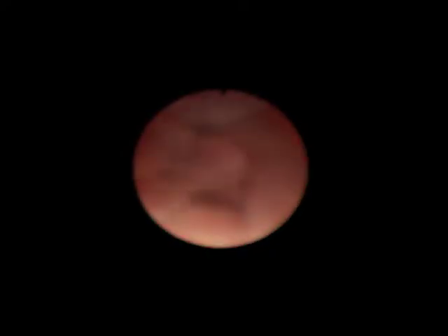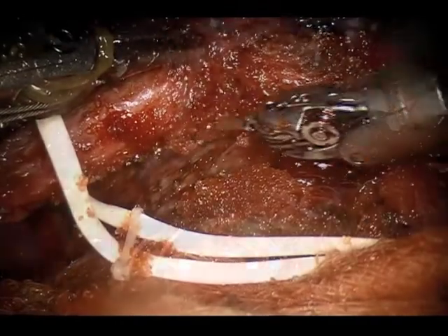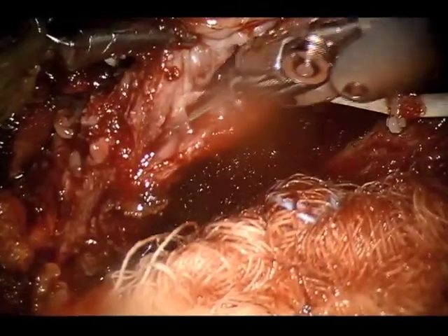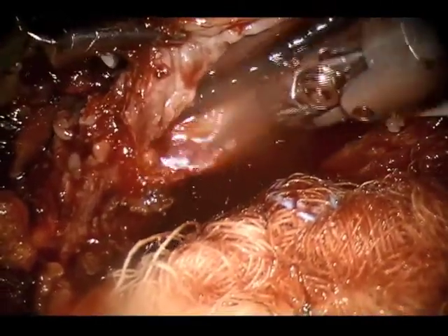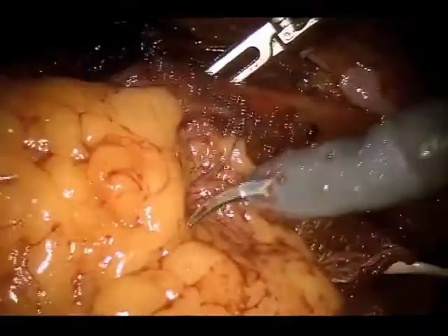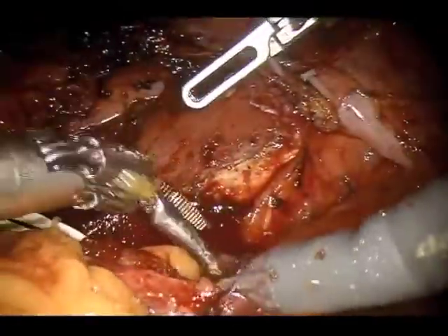Indocyanine green dye was injected, and fluorescence imaging was again used to confirm the proximal margin of healthy tissue on the renal pelvis. The ureter was then sharply incised and spatulated on its dorsal surface. We mobilized a flap of omentum to provide a vascular bed for the buccal graft.